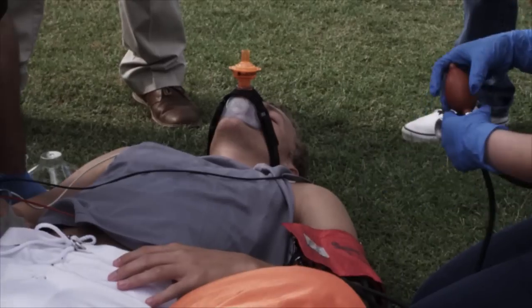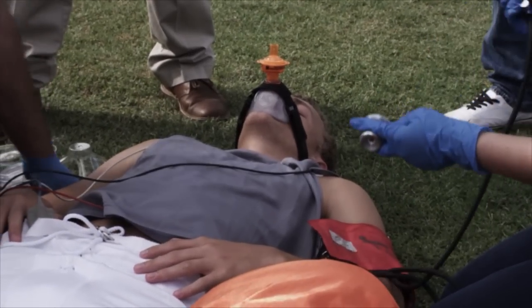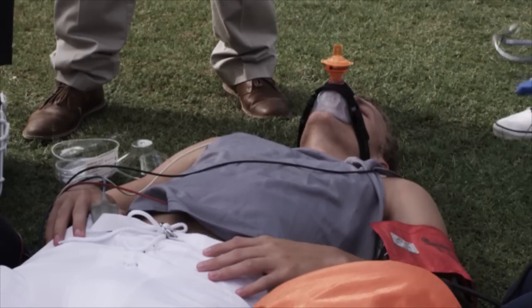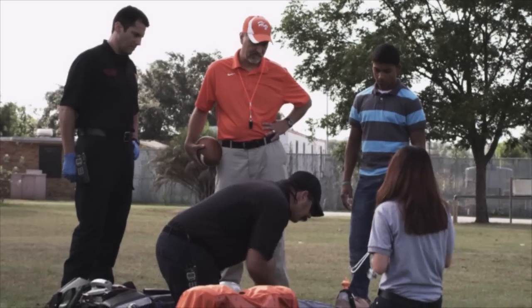All right, what do we got? 128 over 80. All right, we're not hypotensive anymore. Blood pressure has come up. How are you feeling now? Feel a whole lot better? Good to go.